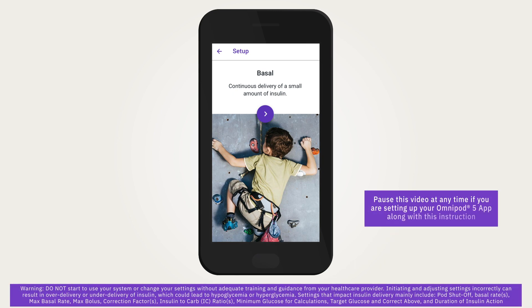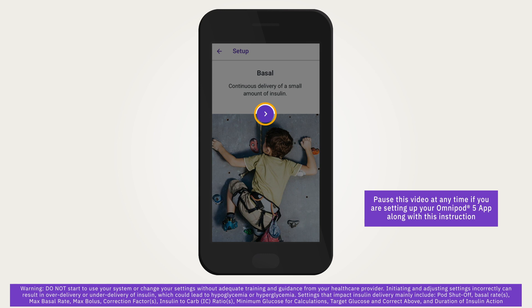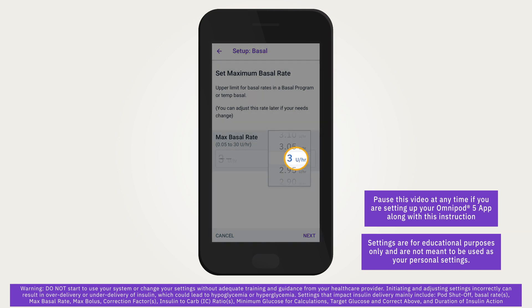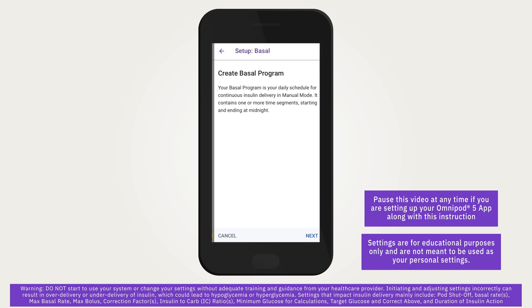Now it is time to enter your prescribed initial insulin settings, starting with basal settings, which will mainly be used to deliver basal insulin while in manual mode. Tap the arrow on the basal screen to move to the next screen. Tap on the max basal rate field, then scroll to the desired maximum basal rate. When the correct number is in the center of the scroll wheel, tap the number to select it, then tap next.